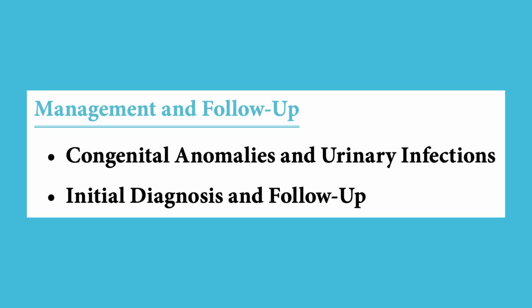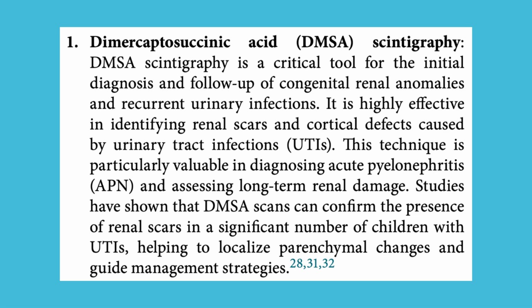Management and follow-up. Congenital anomalies and urinary infections, initial diagnosis and follow-up. 1. Dimercaptosuccinic acid, DMSA, scintigraphy. DMSA scintigraphy is a critical tool for the initial diagnosis and follow-up of congenital renal anomalies and recurrent urinary infections. It is highly effective in identifying renal scars and cortical defects caused by urinary tract infections, UTIs. This technique is particularly valuable in diagnosing acute pyelonephritis, APN, and assessing long-term renal damage.